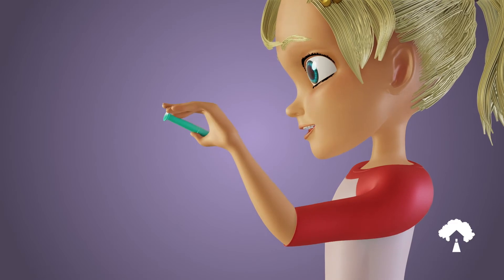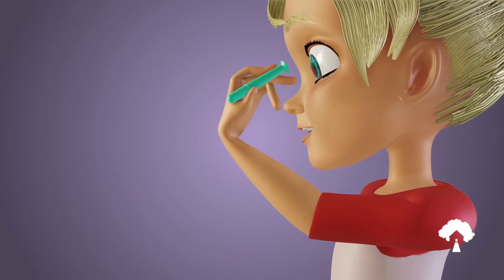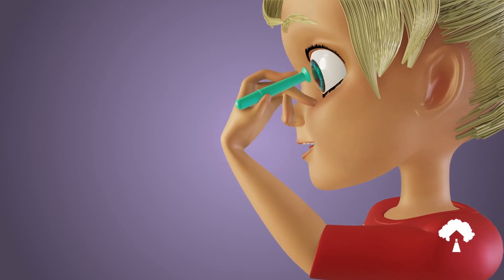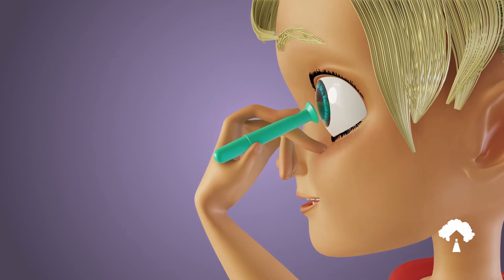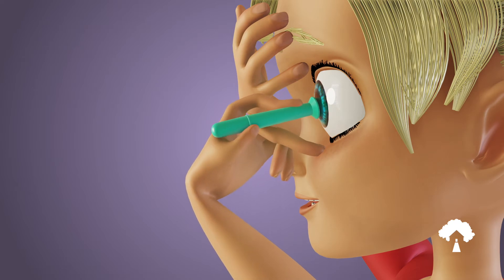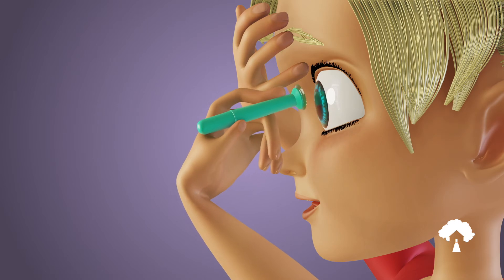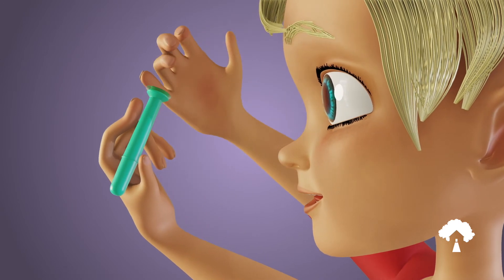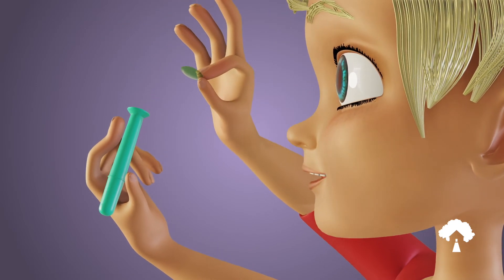If using a lens insertion and removal device, hold the device in between your thumb and index finger with the cup facing your eye. While looking in a mirror, use the middle finger of that same hand to gently pull down on your lower lid. At the same time, use a finger from your other hand to gently pull up on your upper lid. Place the lens insertion and removal device on the surface of the lens. Once the cup of the remover is completely touching the front surface of the lens, the lens should adhere to the device. Gently pull the insertion and removal device away from the eye, which will remove the lens.